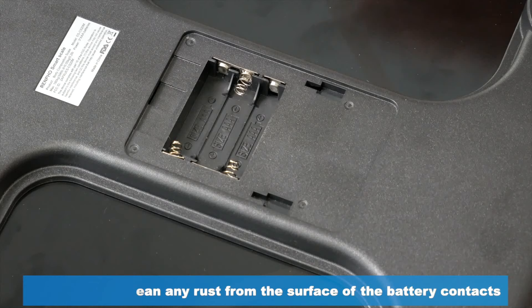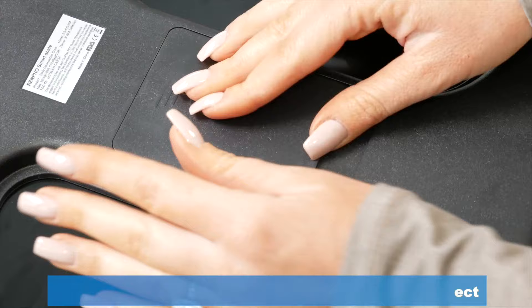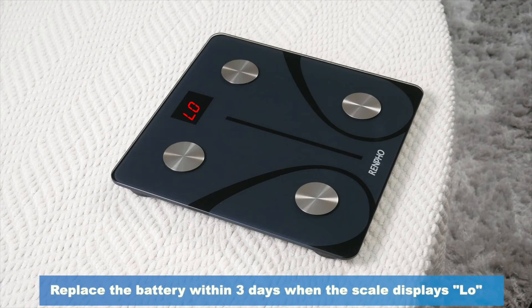Please ensure the positioning of the batteries is correct. If not, the scale will not work. Replace the battery within 3 days when the scale displays LO.